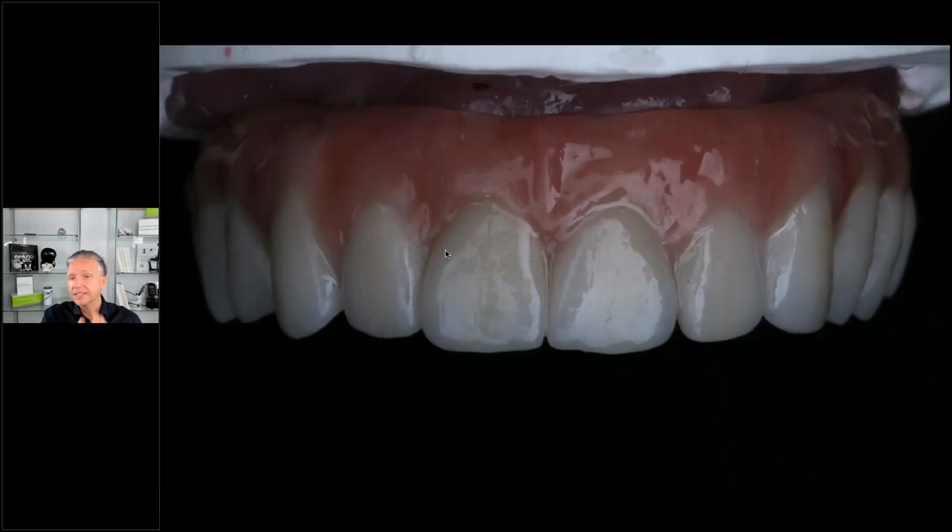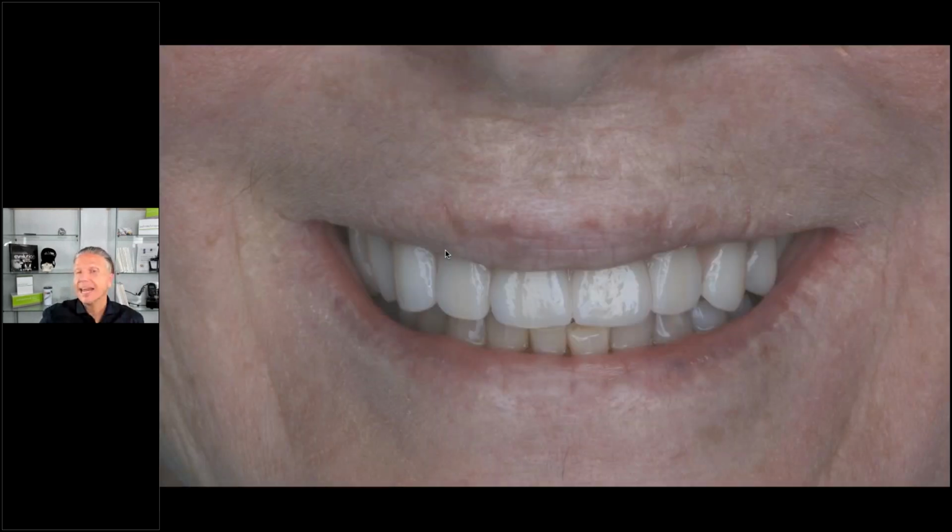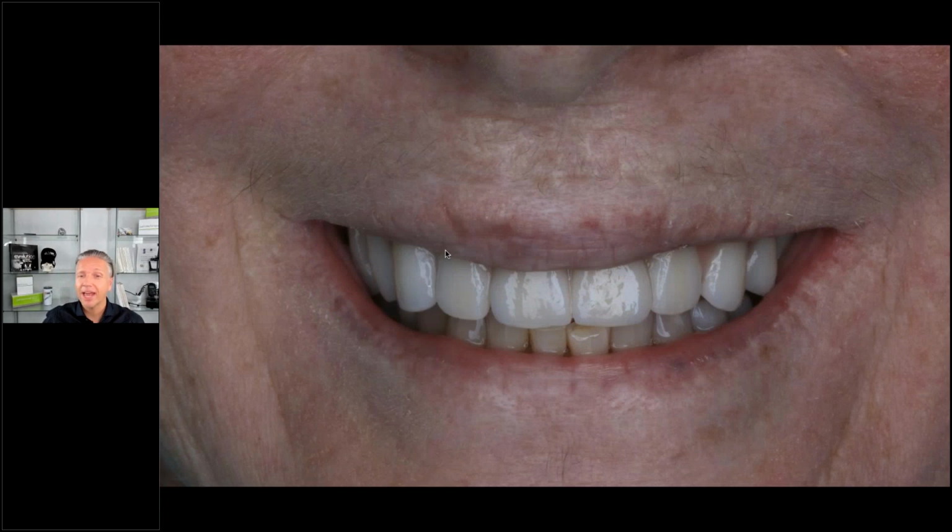And the patient was very happy; she liked the color then. She said, "Oh yeah, that's actually lighter than my lower, so I love it. I'm totally in love with the restoration. It's perfect." So that's how she went home. And you see the gradients we were achieving just with stain and glaze. It's very natural. It's very nice, especially with the underneath preparations of that Pecton. It gives a natural effect. It really looks very nice and comes across very natural.